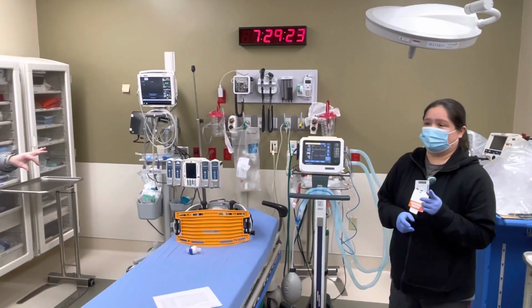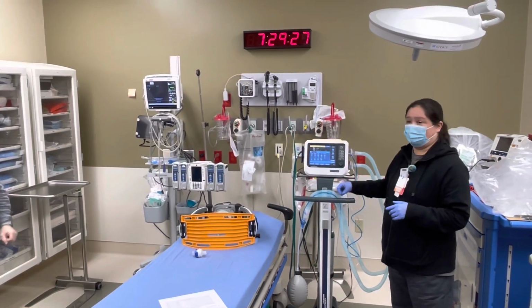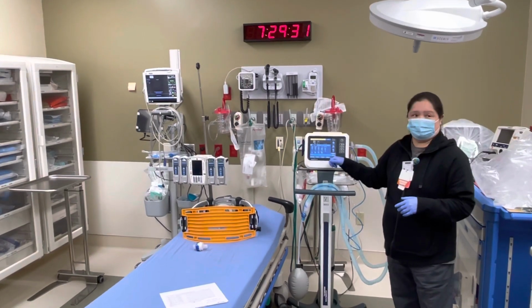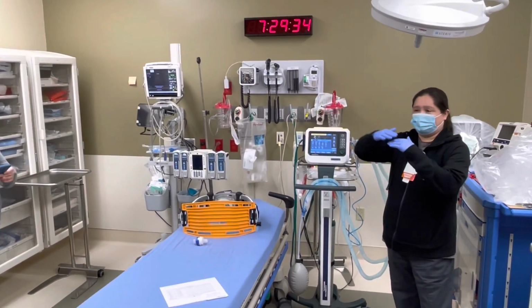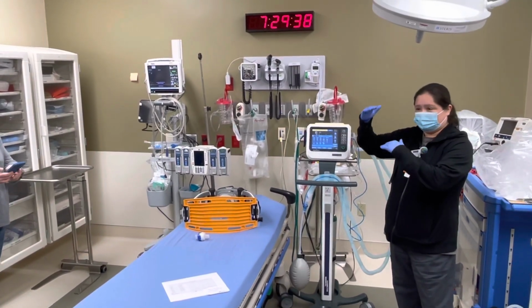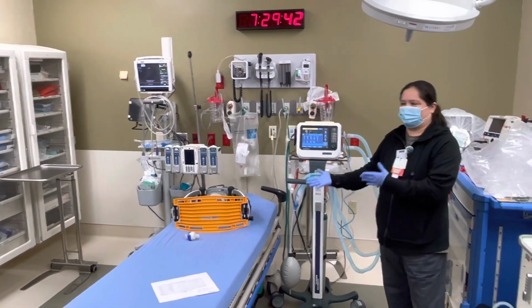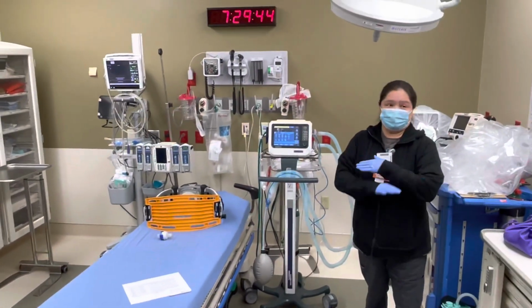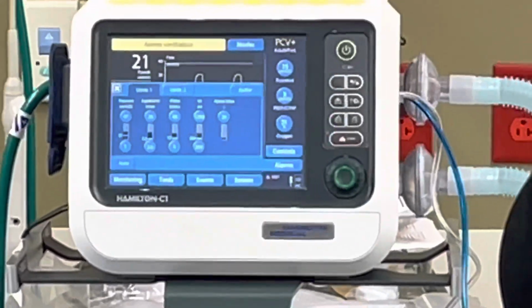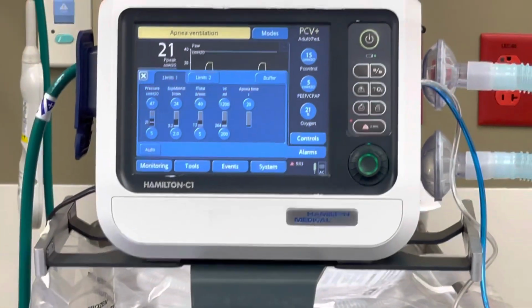Or also check those alarm settings, because every time you turn this off and back on, it resets all of these settings. So I usually open them up, get my patient on it, and then close them up a little bit. I always try to give them a little room in case they cough or wake up. But for y'all, they're just sedated, so you could tighten the alarms up a little bit, so when it alarms, you'll know something's wrong, meaning I'm not getting a volume.